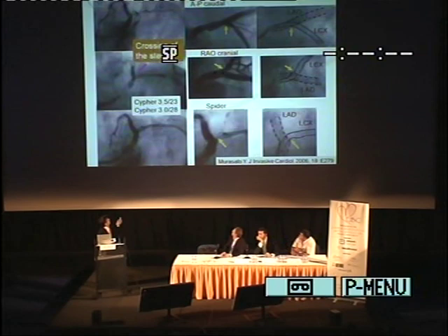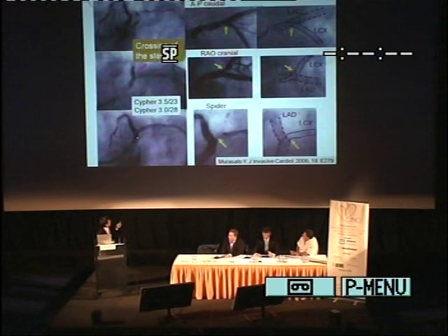We treated the SKS for this region and finally got excellent results. However, six months later, follow-up angiography showed restenosis at the LCX ostium here. In careful fluoroscopic observation, we found the restenosis occurred at the crossing point of the two stents.